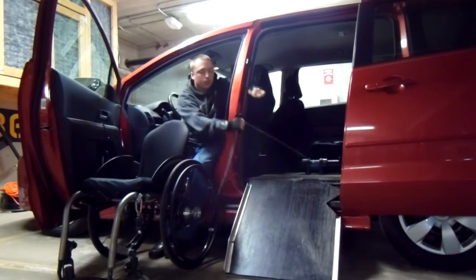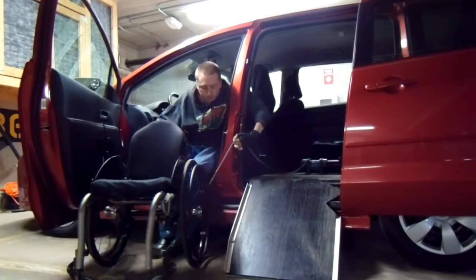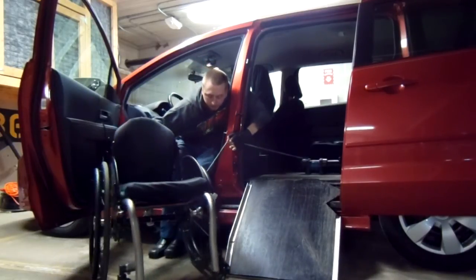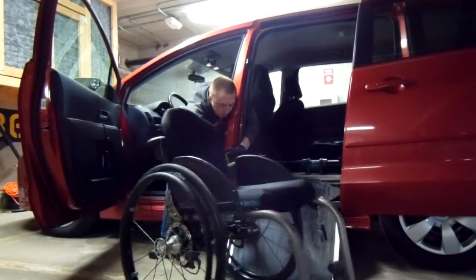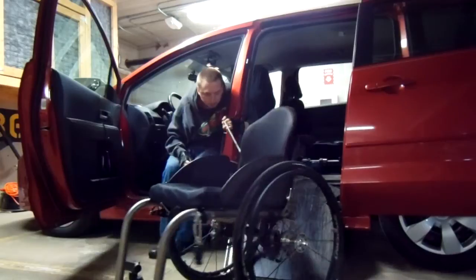The ramp is pretty light — it's just made out of 3/4 inch plywood — so I can lower it. Then I just move the chair and position it so it can go up the ramp. I use the rope to sort of guide it.